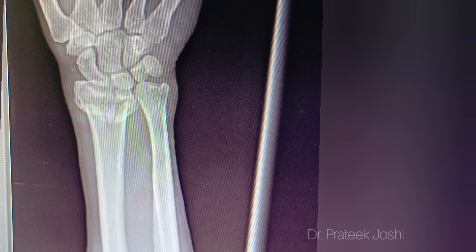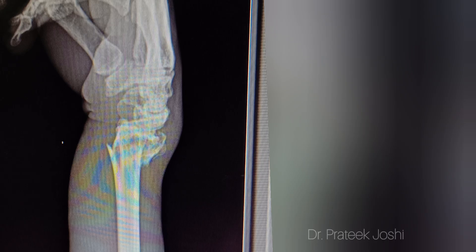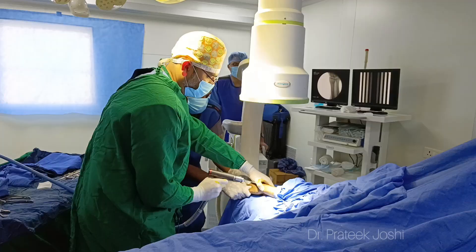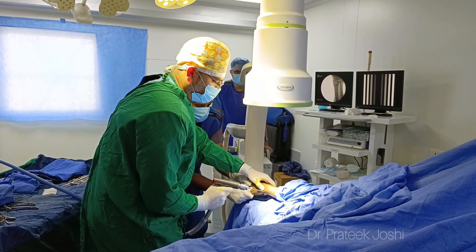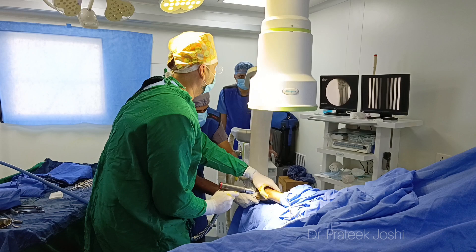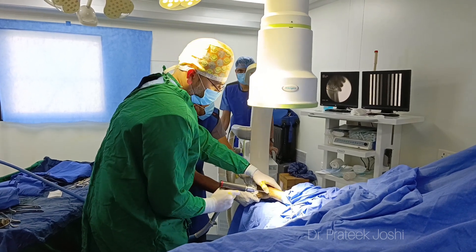This patient has fallen from height onto an outstretched hand and has developed a significantly displaced distal radius intra-articular comminuted fracture, for which we are going to do a K-wiring procedure. Ideally in this kind of case we should do open reduction internal fixation with plating, but because of financial issues we are going to do K-wiring in this person.